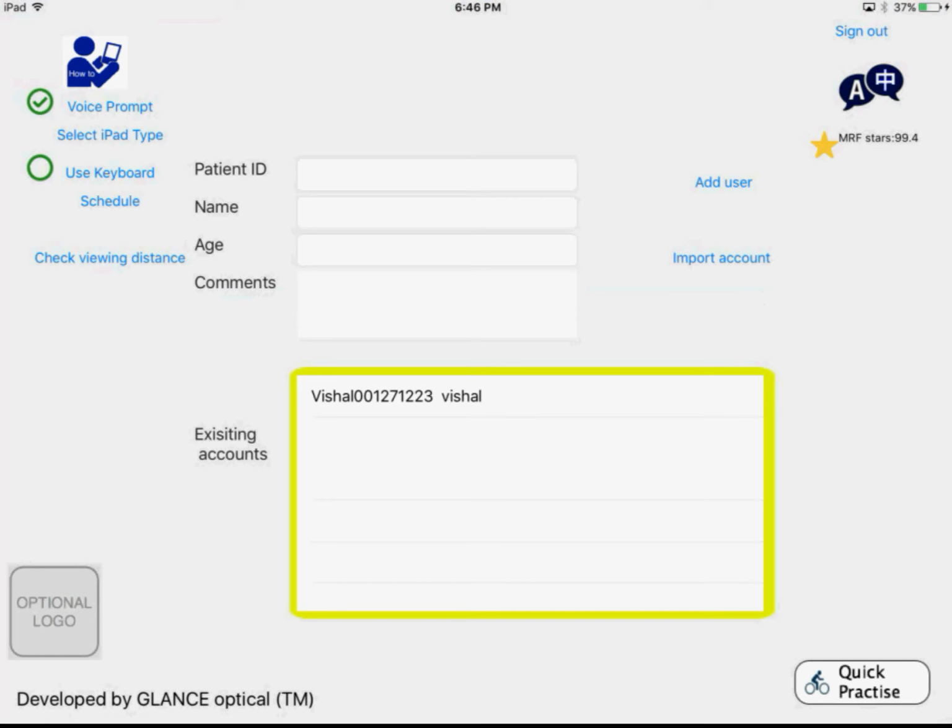And this change in fixation allows the visual field testing up to 30 degrees in the horizontal meridian and 24 degrees in the vertical meridian, which is suitable for visual field loss assessment. There is a lot of documentation and material available for explaining the science behind the test and all the clinical studies, which are available on request. I won't get into them here right now, but this is more for demonstrating the test.